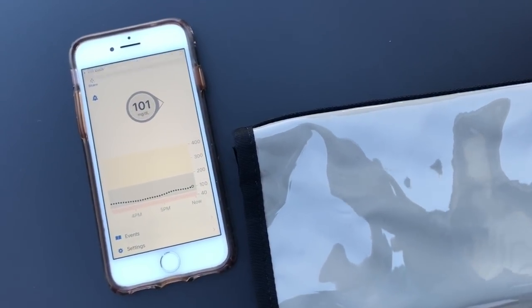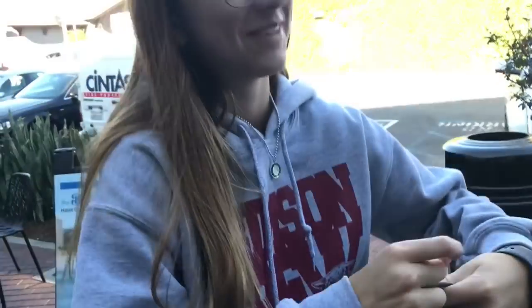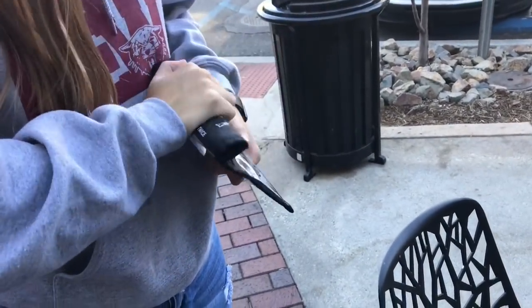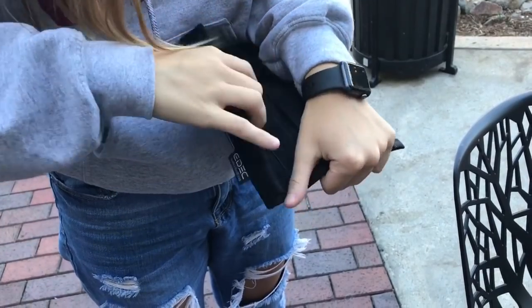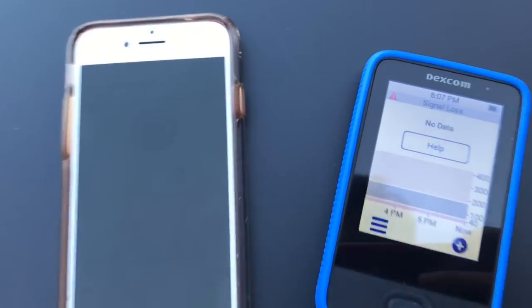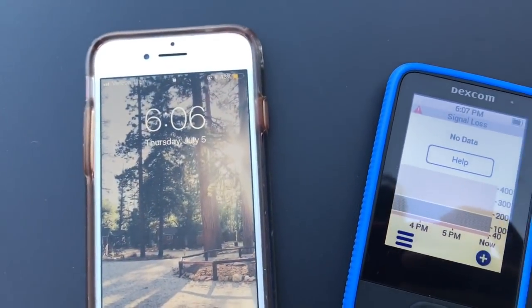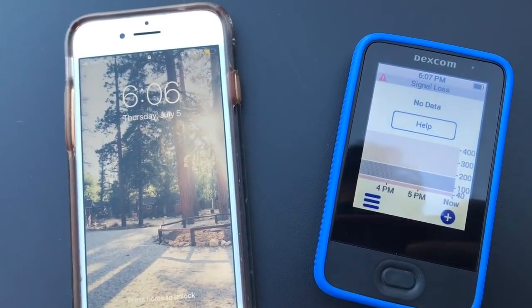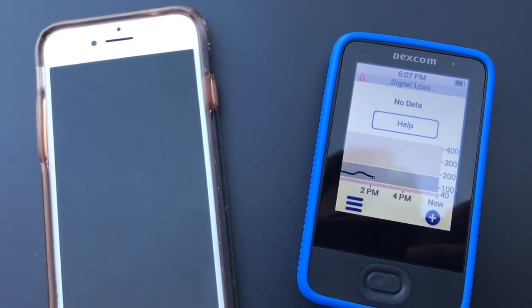It's been over two hours. We've had data the whole time, and now we're going to open up the receiver and pull it out. Okay, so we will now turn it on. You can see it says no data, help, signal loss at 6 or 7. So basically, in another five minutes or so it's going to connect, and we're going to see the warm-up — the two-hour warm-up pie chart. We'll come back to that in just a sec.